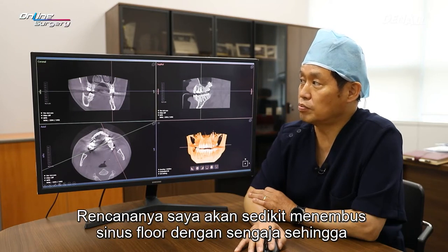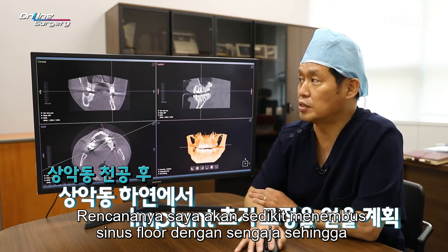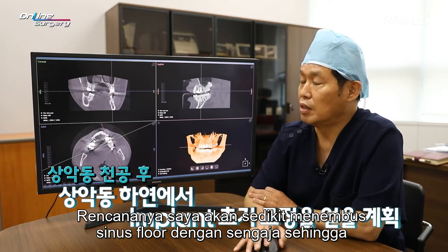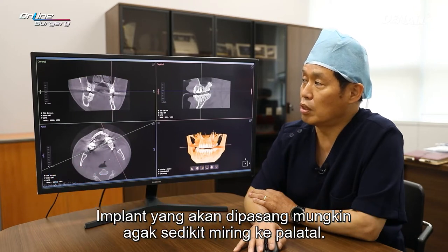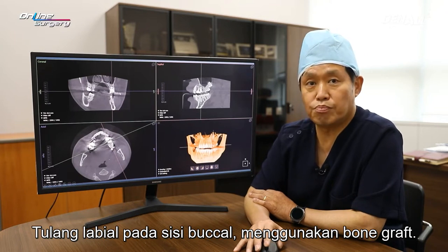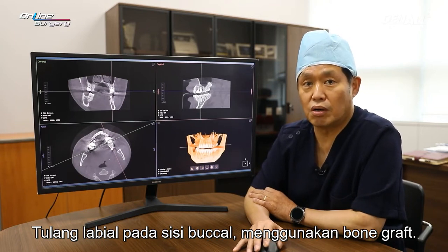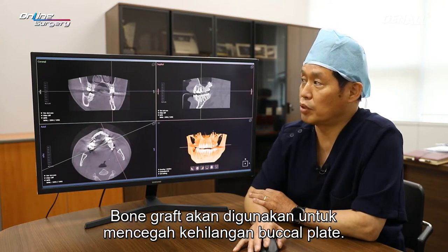My plan is to intentionally penetrate the sinus floor slightly so we can get primary stability from the apex. The implant to be placed is going to be slightly palatally inclined. The labial bone on the buccal side, using bone graft. Bone graft is going to be used to prevent buccal plate loss.